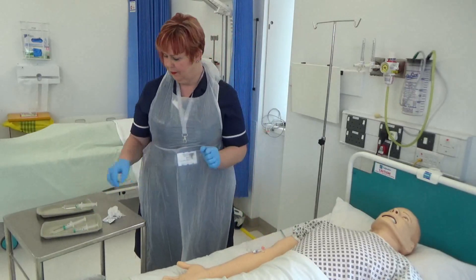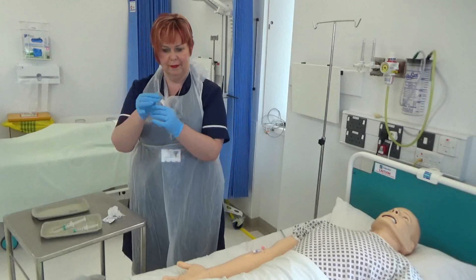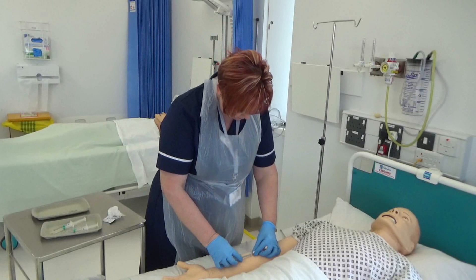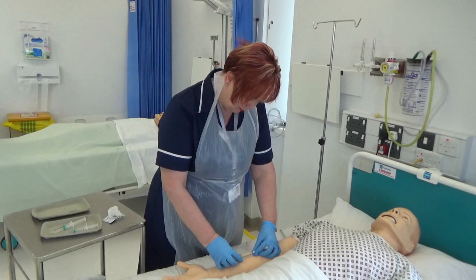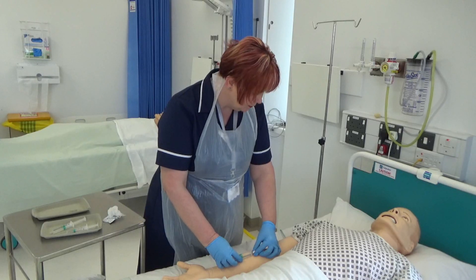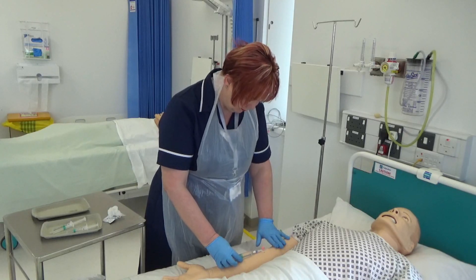Then connect the syringe containing the medication to the needle-free device. Inject the medication smoothly into the cannula over the recommended time of administration, observing the cannula insertion site throughout. This is to prevent excessive pressure within the vein.